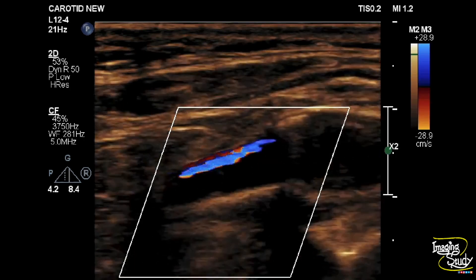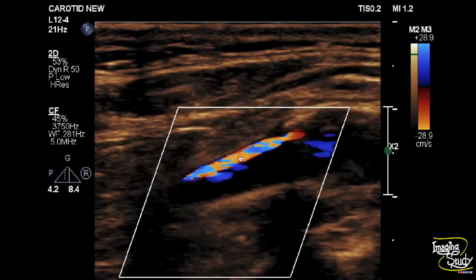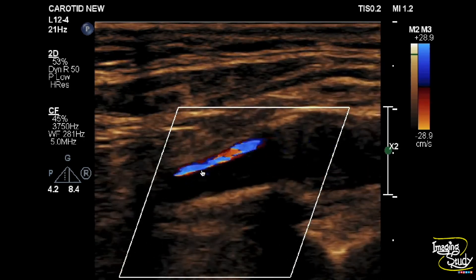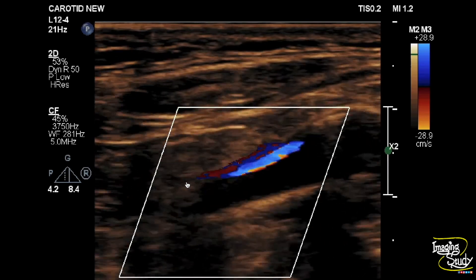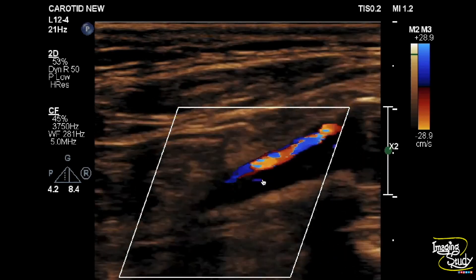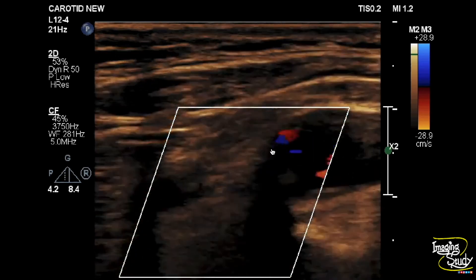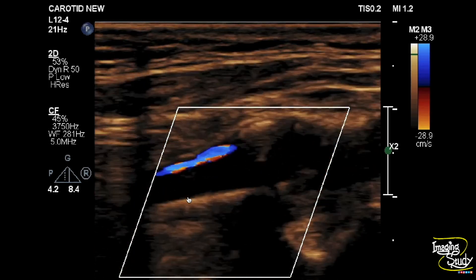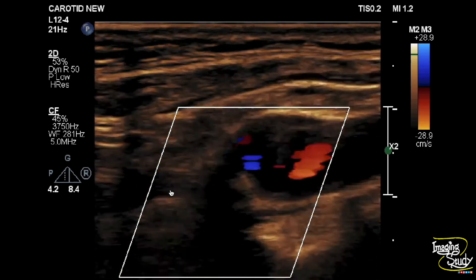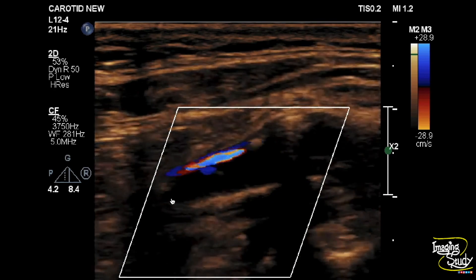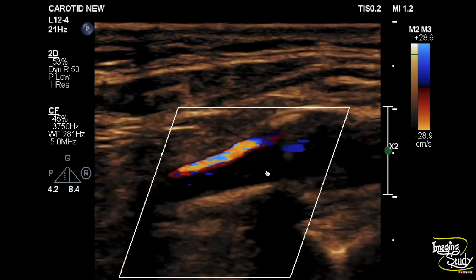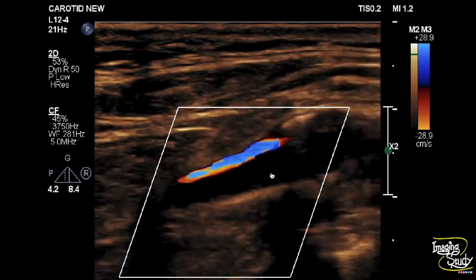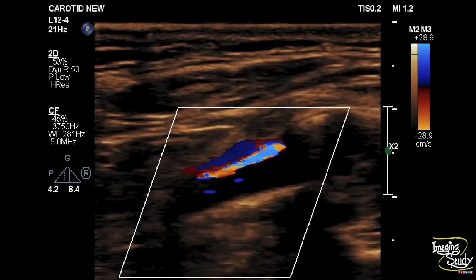Now when we apply color Doppler, you can see there is turbulent flow with aliasing and the lumen is significantly stenosed. There is a type 1 sonoleucent soft plaque causing severe stenosis here.